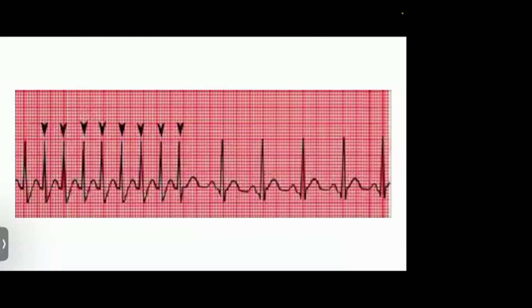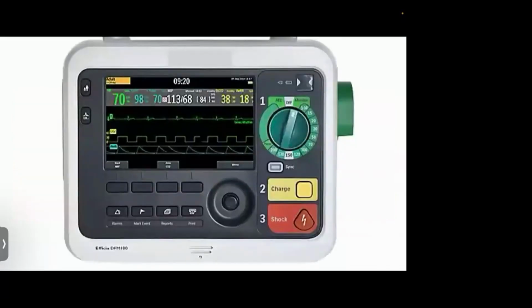So what happens if you don't synchronize in such kinds of arrhythmias? If the machine provides the current on the T wave, the heart actually gets confused and you get the R on T phenomenon, where you can have torsades. You can actually worsen the patient by giving them torsades. So in such cases, you have to avoid any asynchronous shock and you have to synchronize with the R wave. That is why synchronous cardioversion is actually necessary.